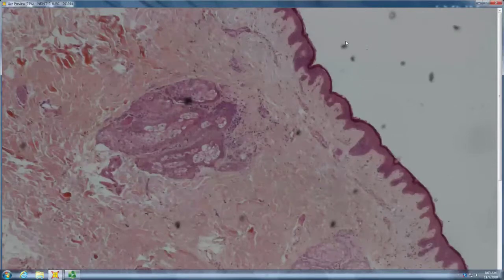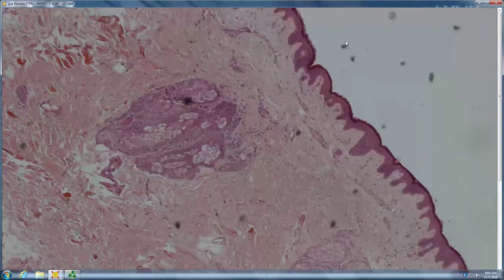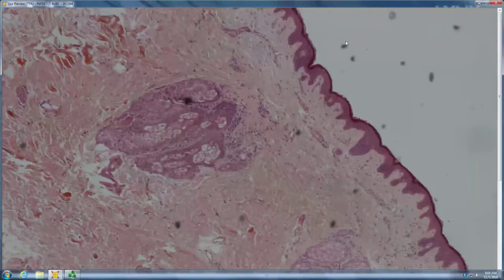And so this is someone with hair that's just not regrowing after many cycles of chemo, a complicated course of cancer. It's just kind of exhaustion of your stem cells, and the hair just involutes to a sebaceous follicle, and you're not growing terminal hairs anymore. And you don't have any fibrous tracts at that point. They just go away.